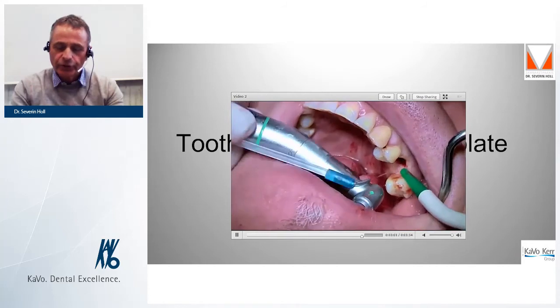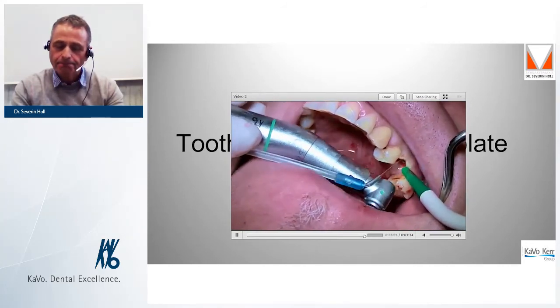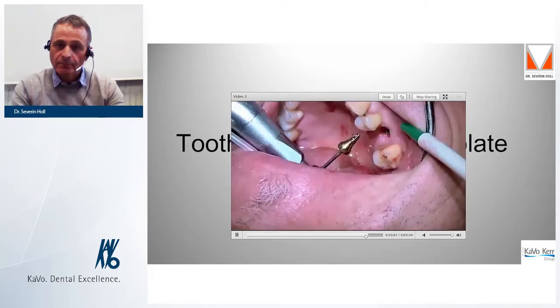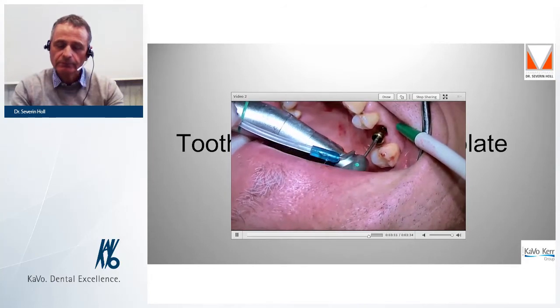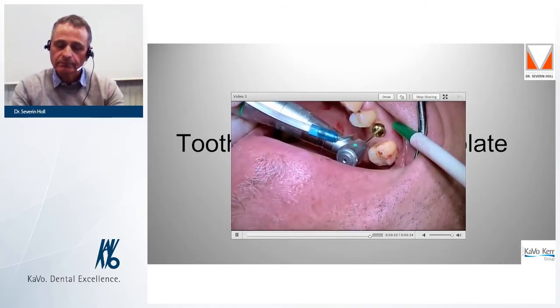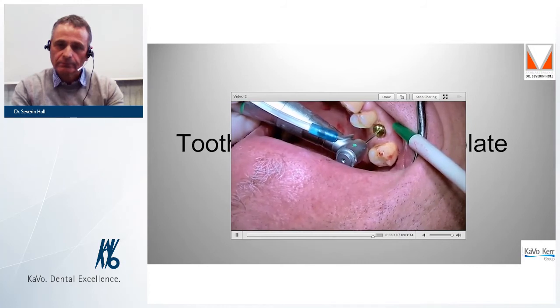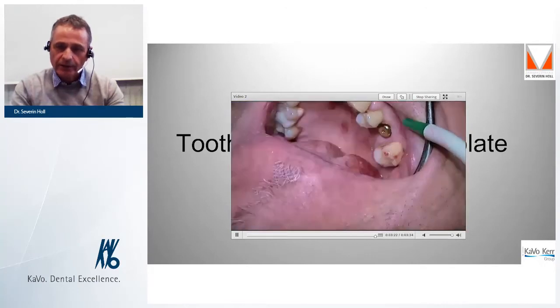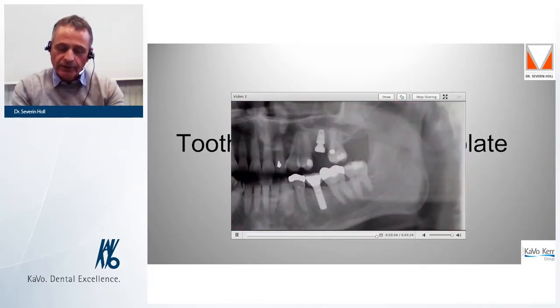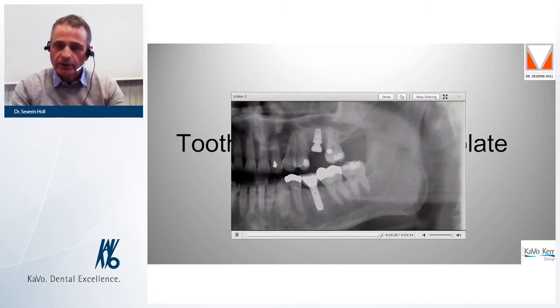We rinse the surgery side and place the healing abutment. Check it by hand, and the control X-ray shows the correct implant position and a nice internal sinus lift.